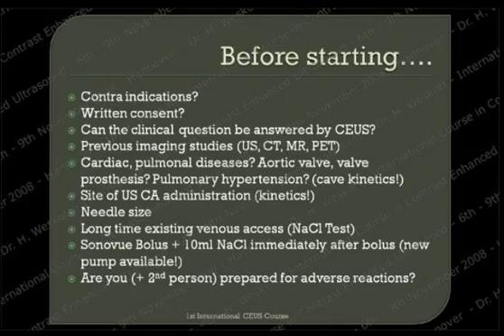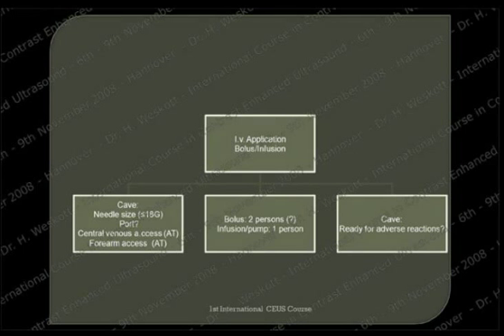So this is a new pump, and it looks quite good, and you don't need a second person for the injection. So this might be the advantage. Disadvantage, if you do everything on your own, you have to be prepared, of course, for some adverse reactions. So I always feel a bit better when there's a second person nearby. So, okay, you have to take care of the needle size. We would advise to take needle sizes bigger than 18 gauge.